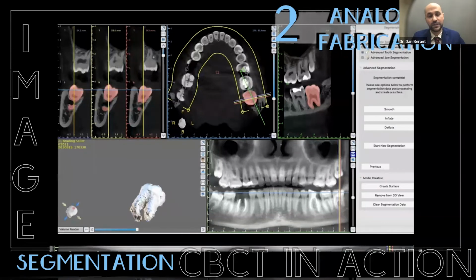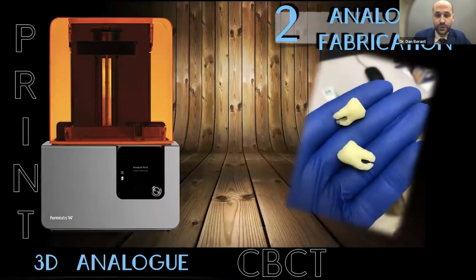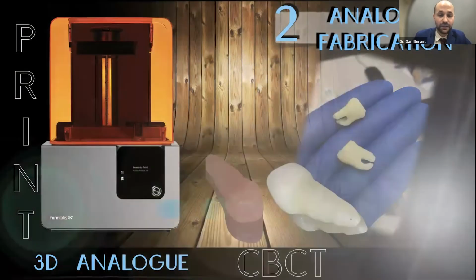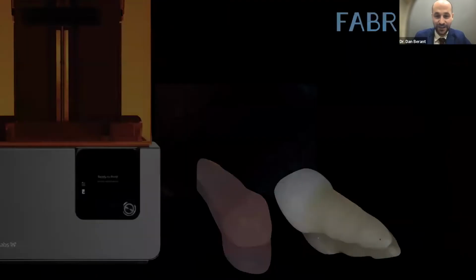And then you can see on the bottom there an STL file, which we can then take to a printer and have it printed. And so here you can see those wisdom teeth being printed. The other thing, now this is the case of the 11-year-old girl, we can not only 3D print it, but what we did in this particular situation is we milled it. And I say we, Dr. Danny Gorgonoyu, who's a perioprostodontist, he and I worked on this case together.